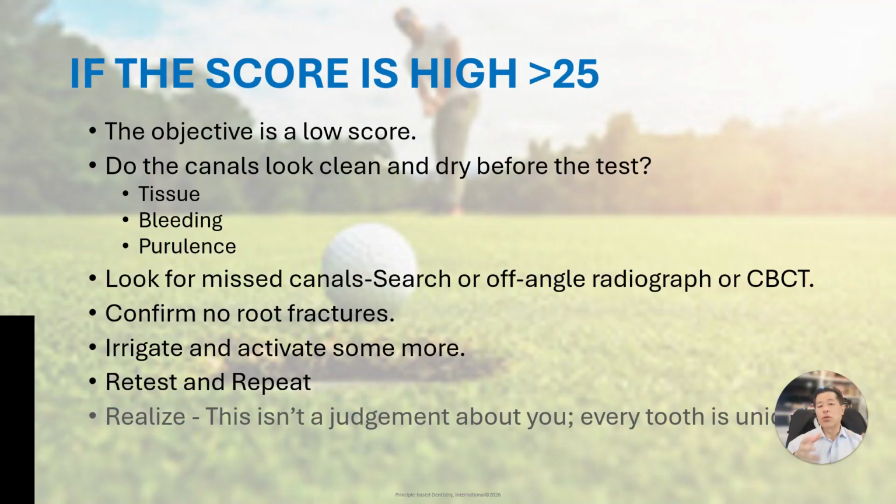If you can't get the score low enough to your satisfaction on this day, then what I'd recommend is put some calcium hydroxide in there, let it sit for a week, get the patient back, remove the calcium hydroxide, and just see what you've got in there. If it still looks dry and clean, irrigate with some sterile water to flush it all out, and then retest and see what your score is.